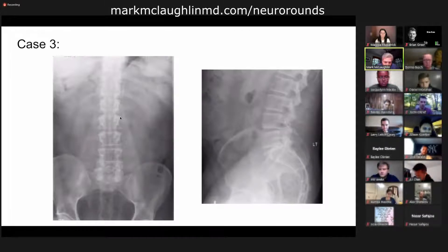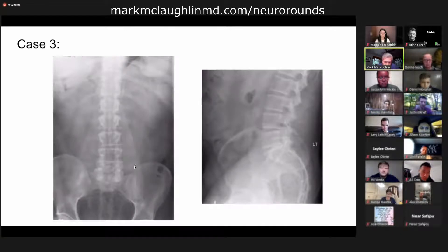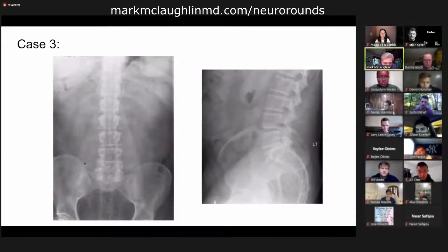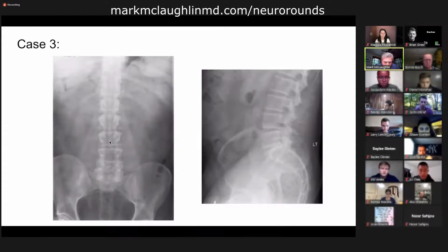Here's the iliopsoas margin — you can see this white line here, this is the iliopsoas muscle. You can pick that up nicely on both sides. Nice, normal, balanced spinal canal. We see the spinous processes here and the pedicle — outline of the pedicle here and the outline of the pedicle here. So this is a good straight-on view. Pedicle, pedicle, spinous process.